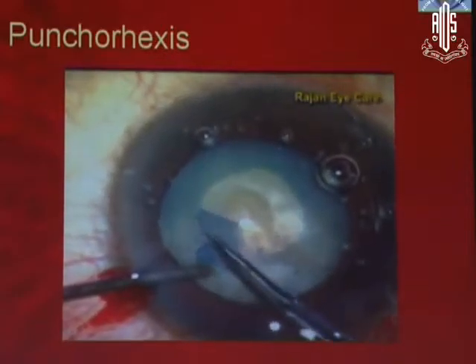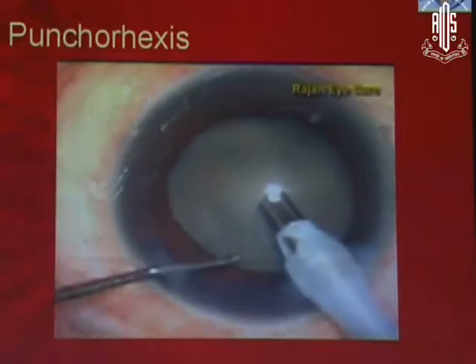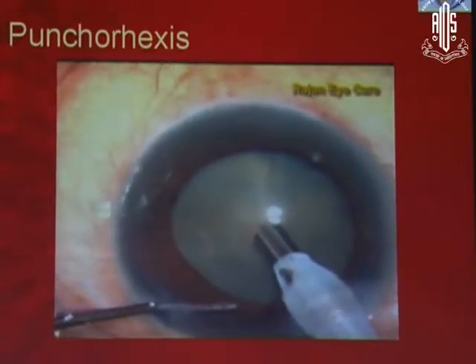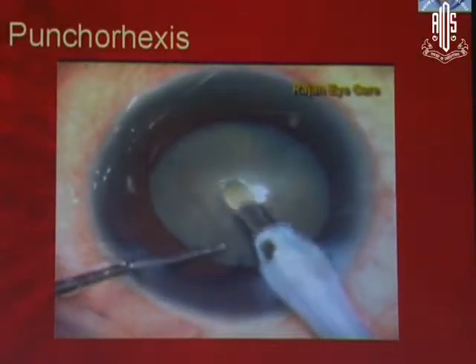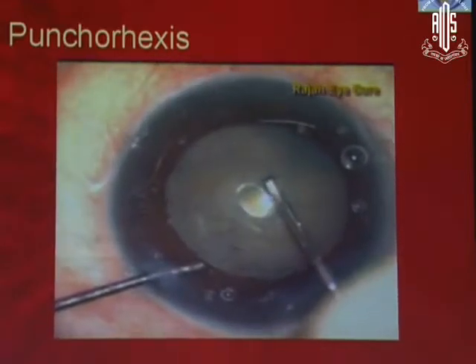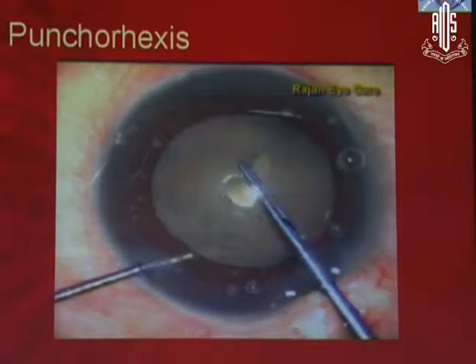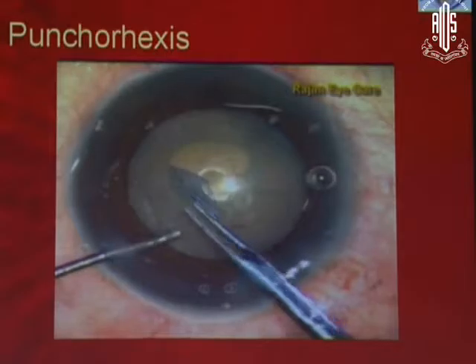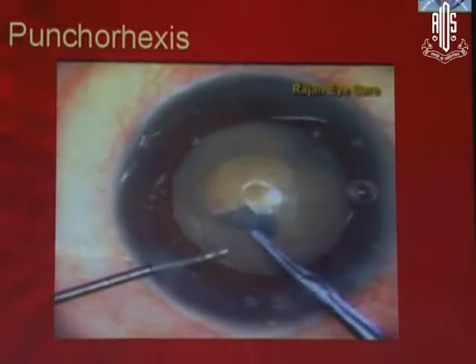Normally in intumescent cataract or mature cataract, you always aim for a smaller size. Here in punchorexis, you don't have to do that. The most important thing is to punch right in the center and go full throttle down on your phaco footswitch. If you go half throttle, what will happen is there is some time for the nucleus to come forward. There are two components: one is pressure in front, another is pressure behind, and also the nucleus is bigger and bulkier. So the nucleus, as soon as you release the pressure, tries to come forward and extend the rexis margin on the other side — and that's why you get an Argentinian flag sign.